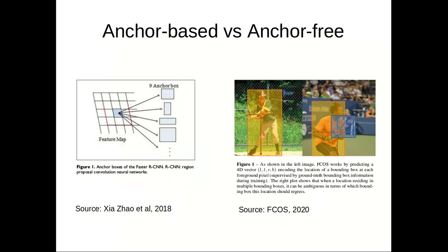The anchor-based versus anchor-free question, however, is a different kind of story. Although there is something very clumsy and annoying with methods that use predefined anchors, we cannot say that they are not justified. It is not a coincidence that the first version of the YOLO algorithm was anchor-free, and then in its later versions, the creators returned to using anchors.